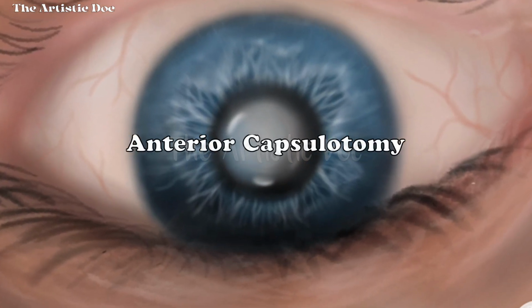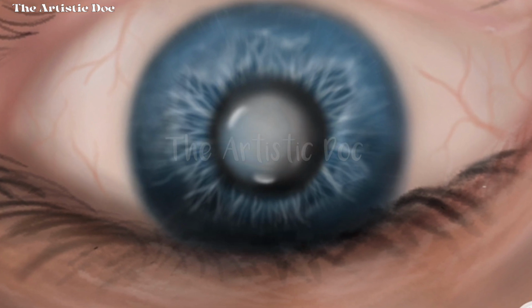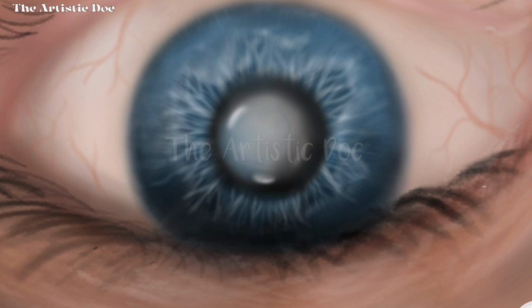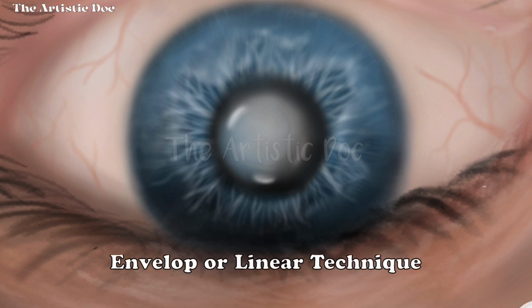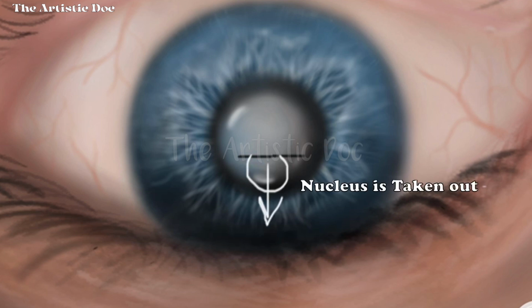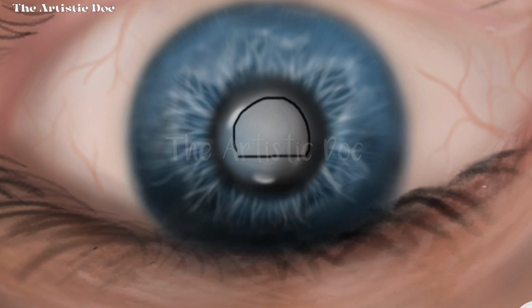Now the anterior capsulotomy is done. There are 3 types of capsulotomy techniques. First, come to the envelope or linear technique. In that technique, a linear cut is made like this. Nucleus is taken out and then completion of the capsulotomy is done.